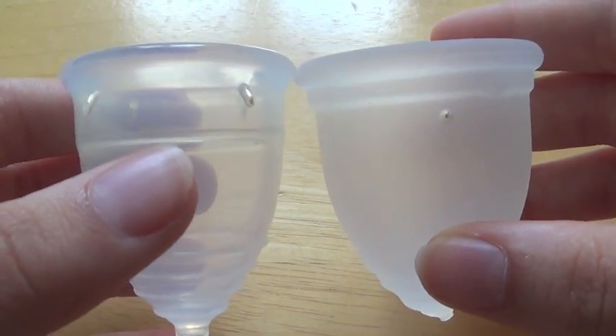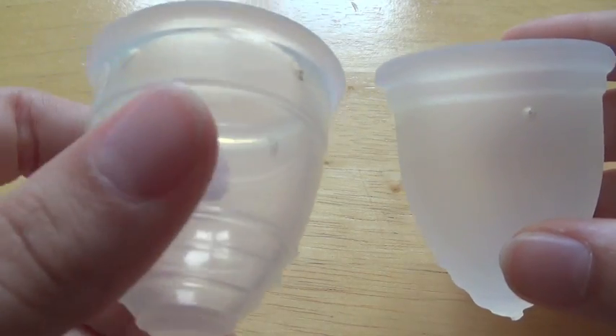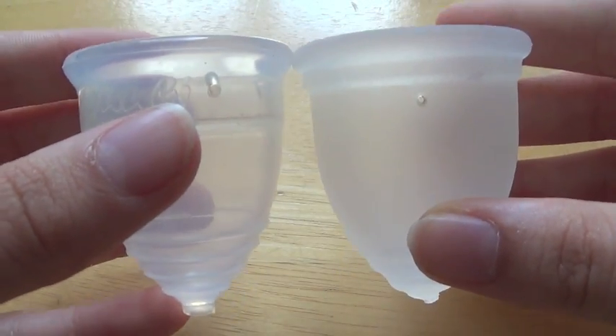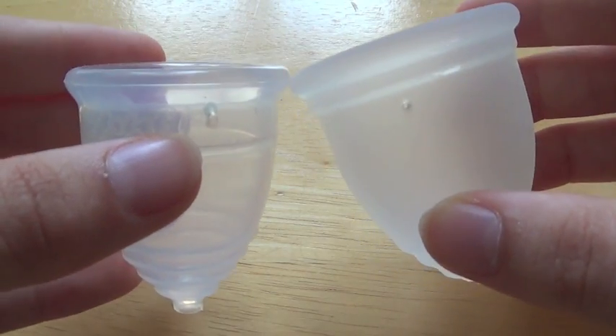I really do like both of these cups. The Yuki Cup has a very good resistance for when I want a cup to just be no hassle and open up very easily inside of me, even though this is their soft resistance. Their shape is very similar, apart from the fact that the Ruby Cup is a bit bigger — this is a one size cup, as I said before.